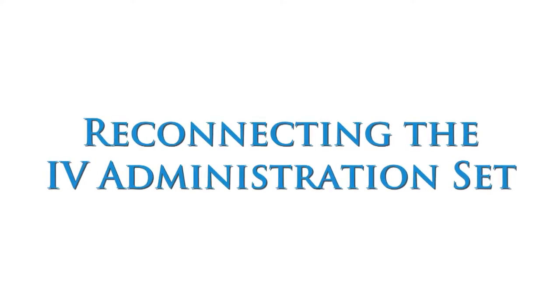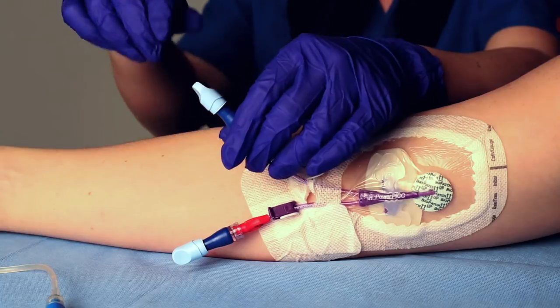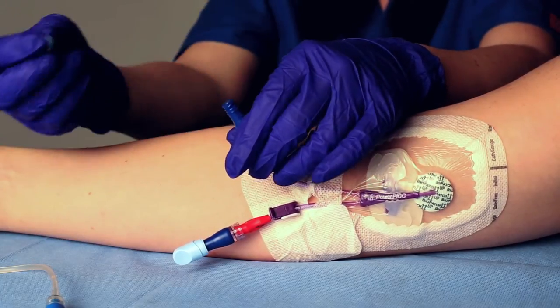To reconnect the IV administration set, remove the light blue dual cap from the Luer access valve by holding the valve with one hand while twisting the cap until detached.